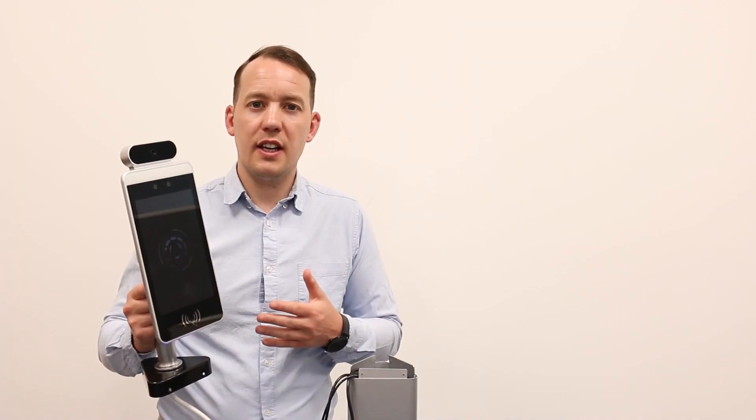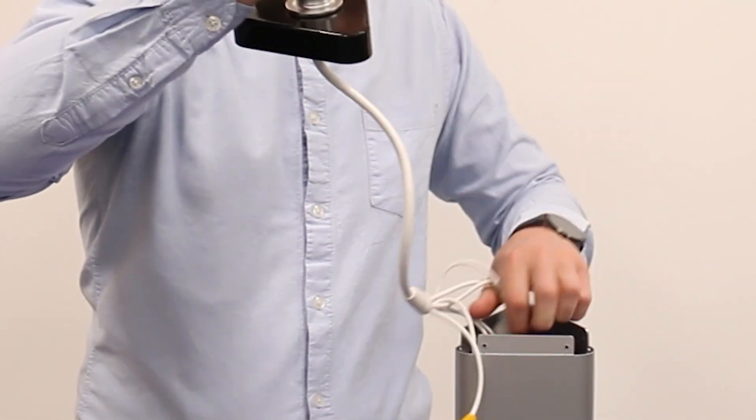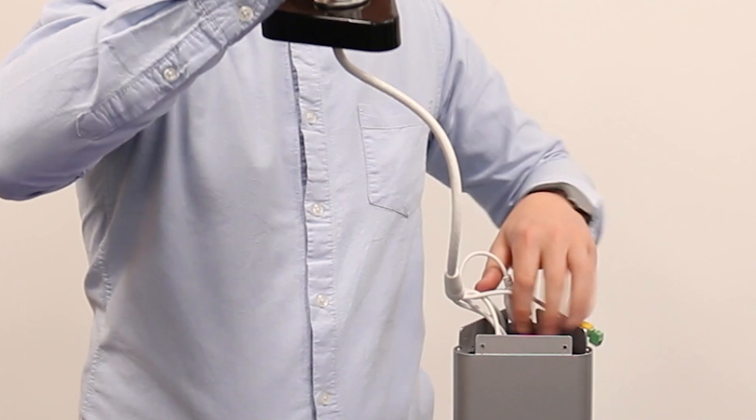Now the device is connected, the next step is to bury the wires inside the pedestal unit and connect the device to the top of the pedestal unit.